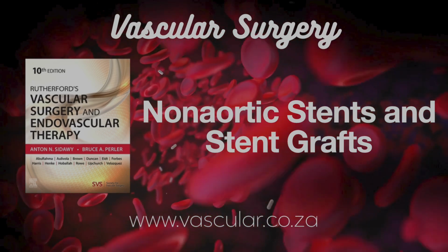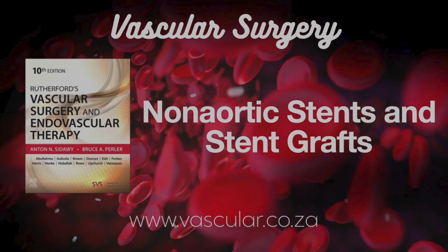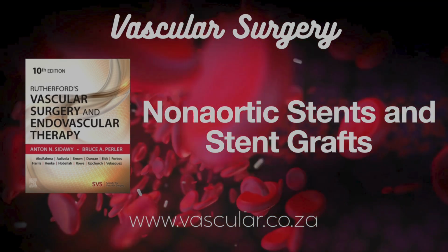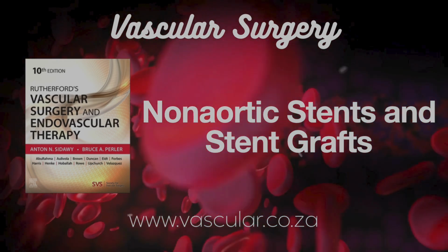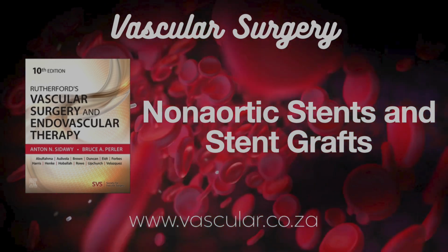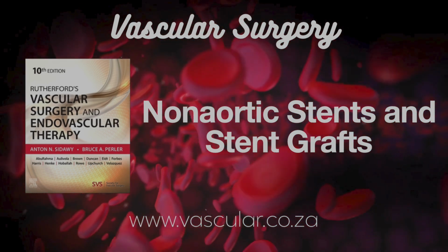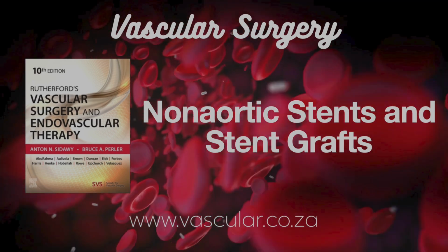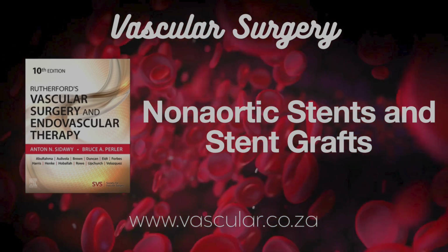But their big plus is that they deploy exactly where you inflate the balloon. Absolutely. Minimal movement. Perfect for lesions right at the origin of major vessels, renal, iliac, subclavian, where you need pinpoint accuracy. But not great for areas that bend a lot, like behind the knee. Definitely not. Too much risk of fracture or getting kinked.